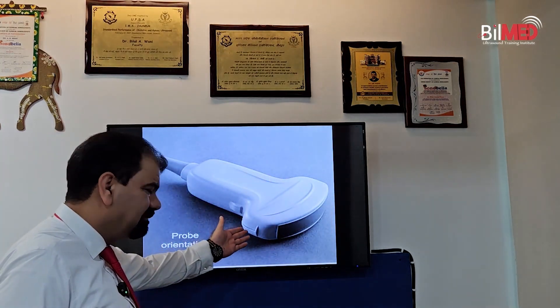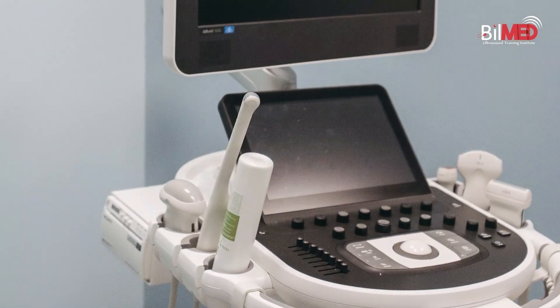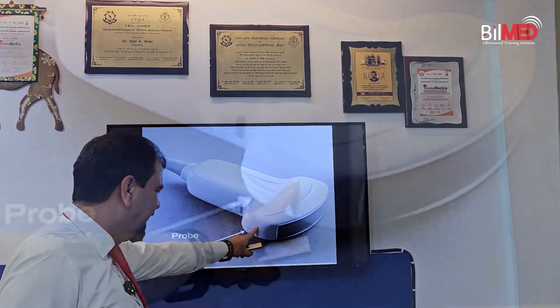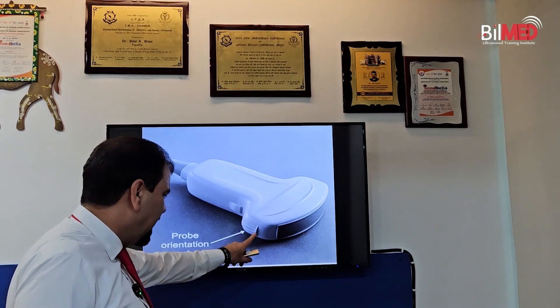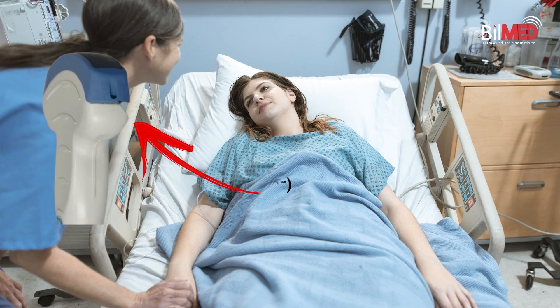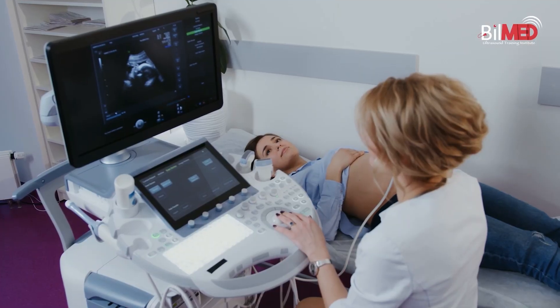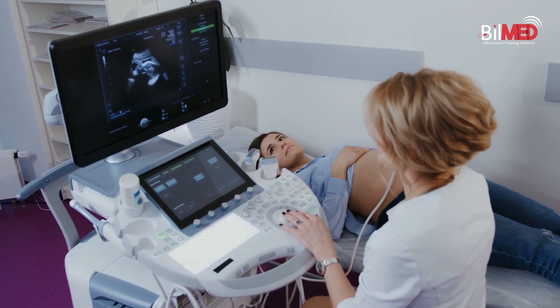This probe marker is there in your probe, and it can be anything — a depression, a logo, an elevation. So pay attention to this probe marker, because it has to be towards the patient's right. Whenever you put a probe on the patient, this probe marker has to be towards the patient's right, because you have to correlate your image. Screen orientation will get reversed if your probe marker is not towards the patient's right.